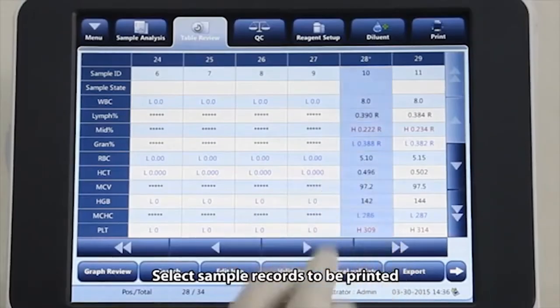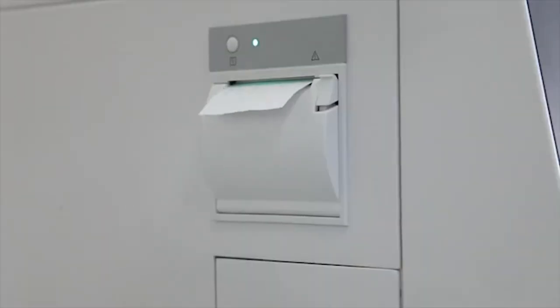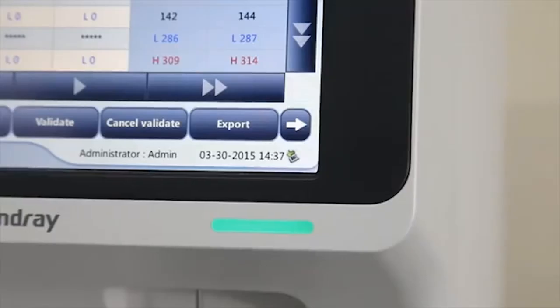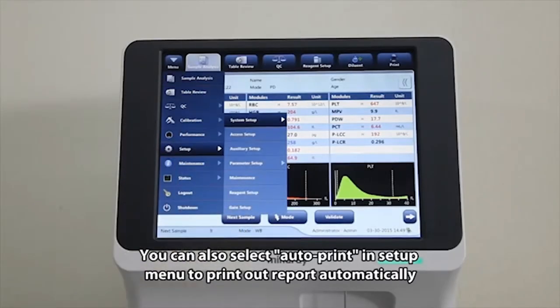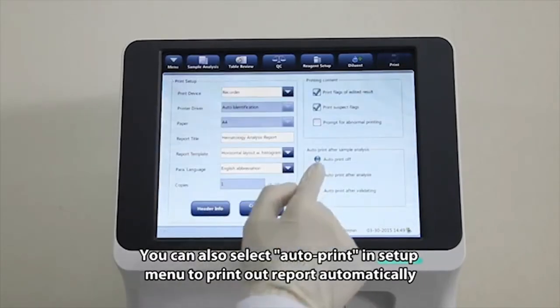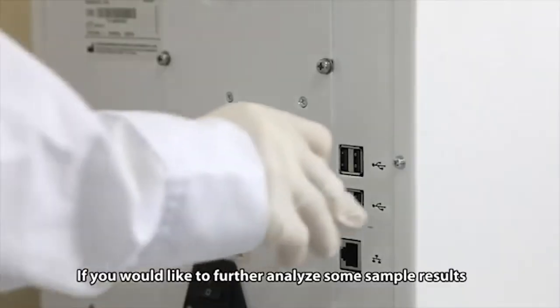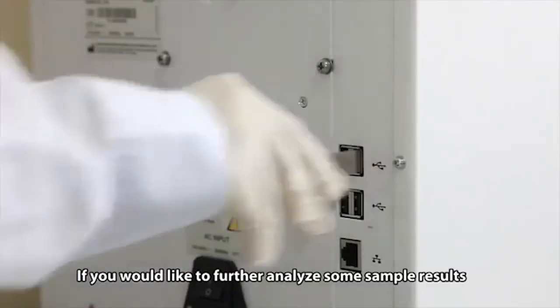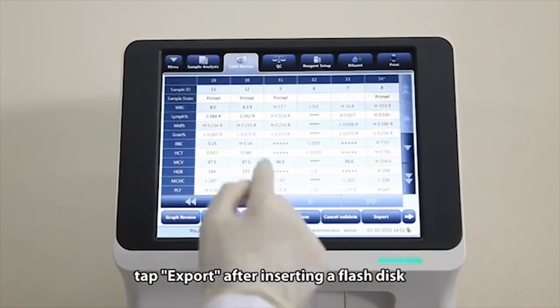Select sample records to be printed and then tap Print to print out. You can also select Auto Print in Setup menu to print out report automatically. If you would like to further analyze some sample results, tap Export after inserting a flash disk.